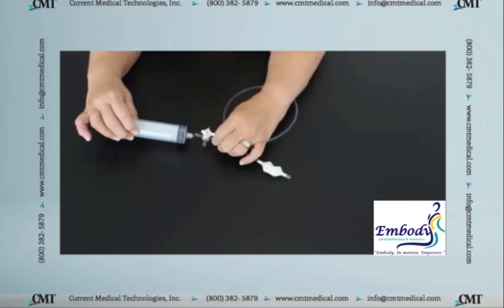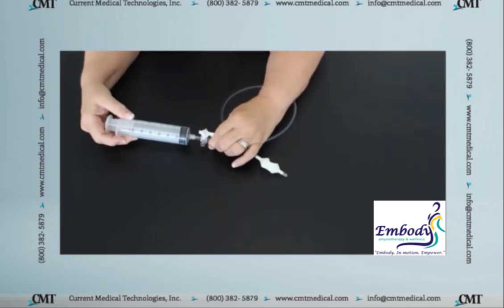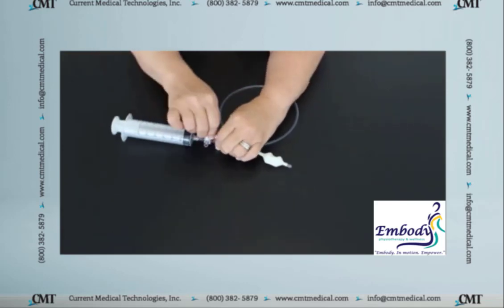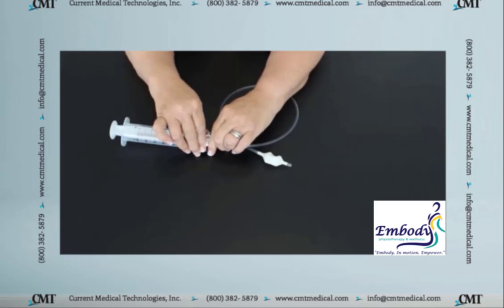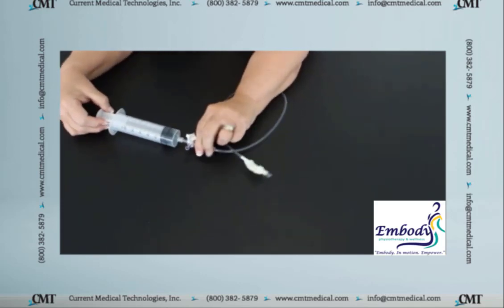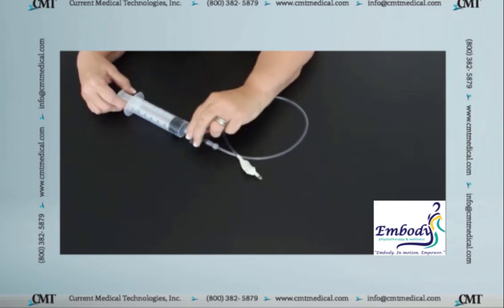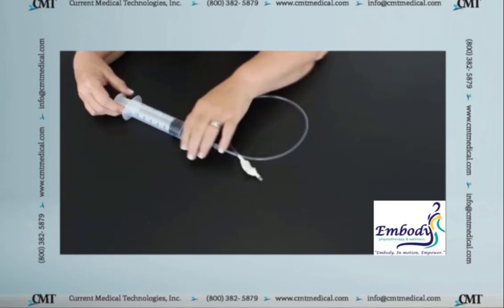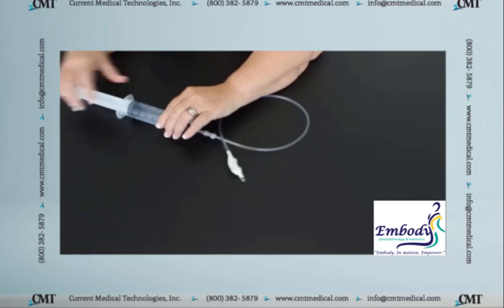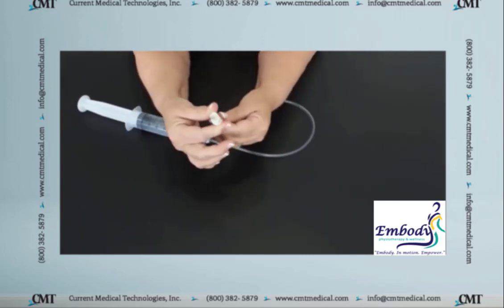Keep the syringe closed and just dial it into the tube. Make sure the balloon is not locked — open it by sending the switch to port two — and just draw some air back. You see that balloon deflate all the way? Draw some air off and then lock the balloon. Now you're ready to pull this all the way back to get started after you insert the balloon, because the balloon is effectively locked now and is completely deflated — you can see that's going to be easy to insert.